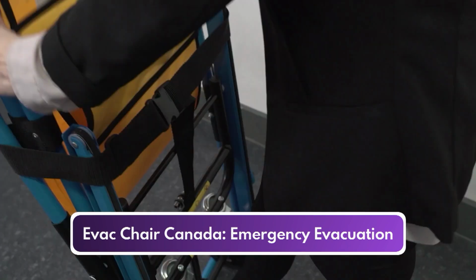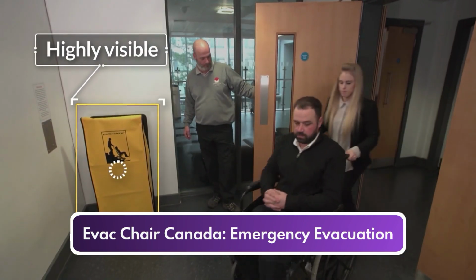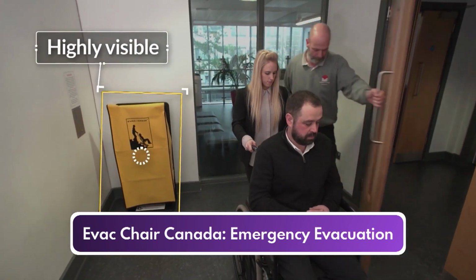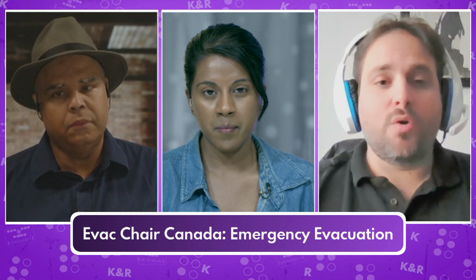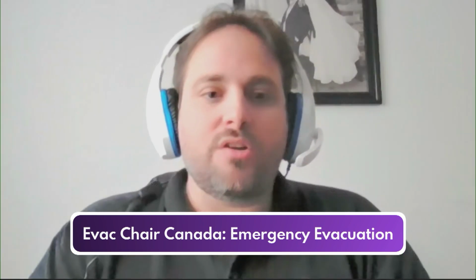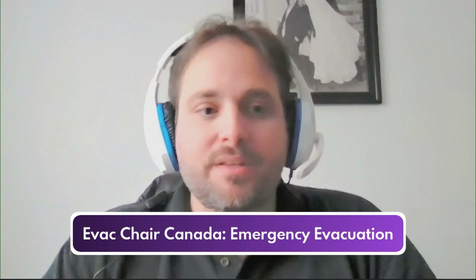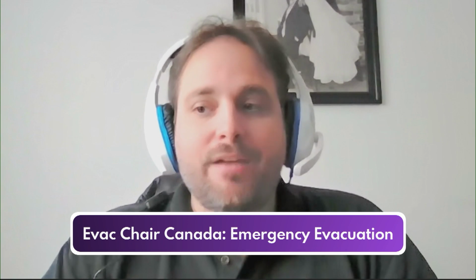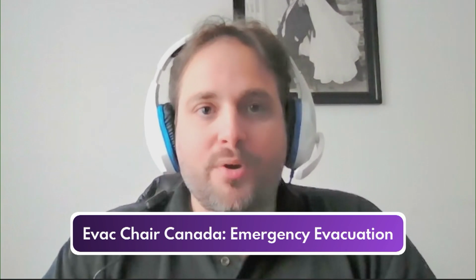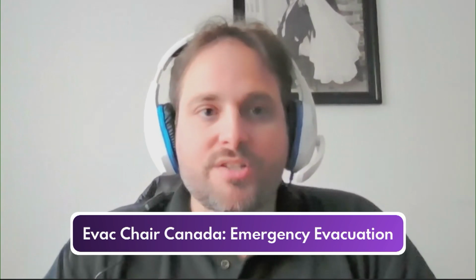Nice. Just to reiterate, there is someone helping the person who uses a wheelchair get into the Evac Chair, down the stairs and out of the building safely, right? Yeah, of course. We want to keep in mind that the Evac Chair is not solely for those in wheelchairs, because we have people with visible disabilities and invisible disabilities, and they may have the upper body strength to self-transport into the chair. If they do not, then the person operating the chair would put the brakes on the chair and possibly bear hug or assist the individual to transfer into the chair safely as well.